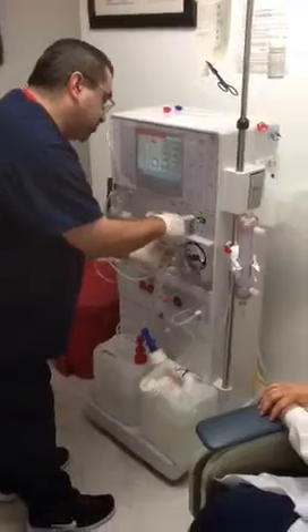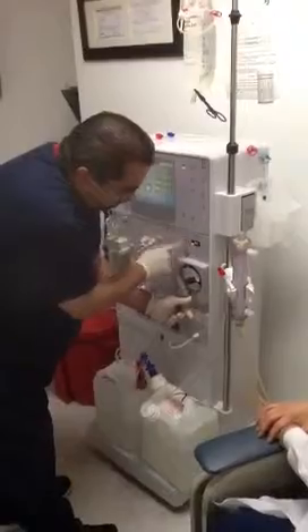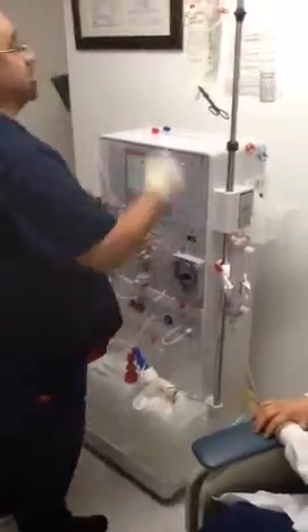Then stop. Let go. Push start again to get the rollers. Grab the blood pump segment and take it all the way in. When it stops at the end, just push it right in there. Shut the door. That's done.